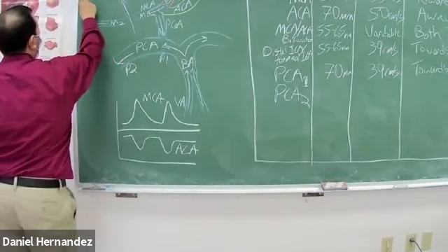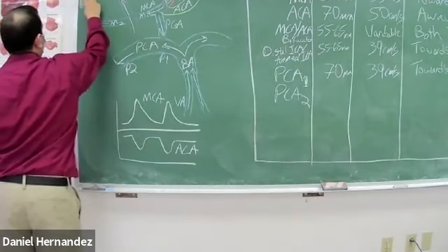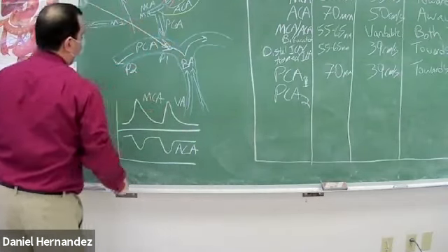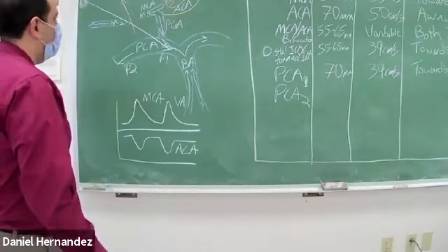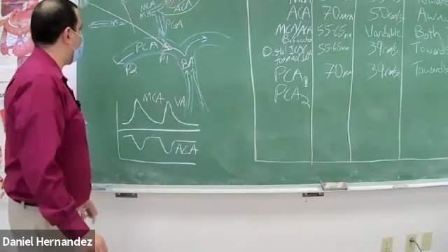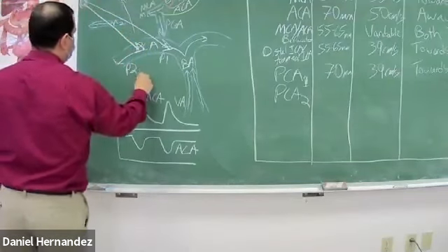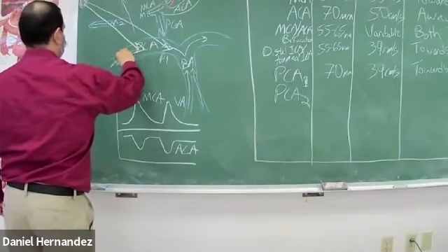So if our transducer transtemporal is in this general location here, we're imaging back at that posterior cerebral artery. Our P1 segment is going to be towards us. If we image more posterior into that P2 segment, that's actually going to be tailing away from your transducer now.